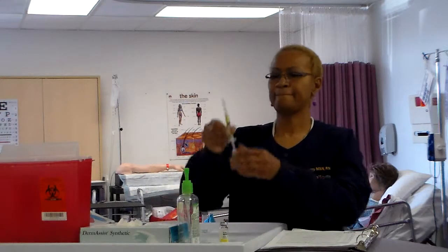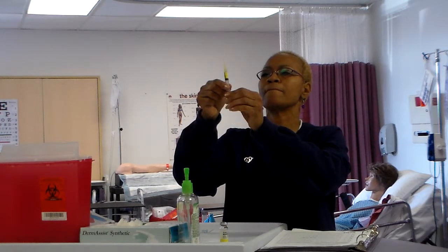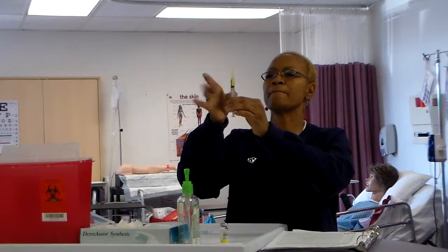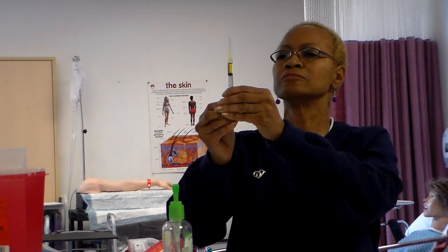Again, the scoop method to recap. Hold syringe at eye level at 90-degree angle to ensure correct volume and absence of air bubbles. Remove any remaining air by tapping barrel to dislodge any air bubbles. Draw back slightly on plunger, then push plunger upward to eject air. Do not eject fluid. Recheck volume of medication.